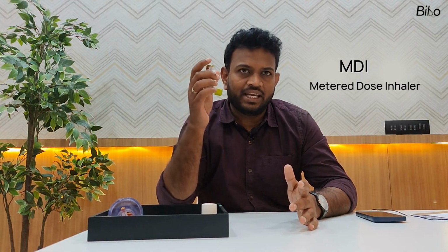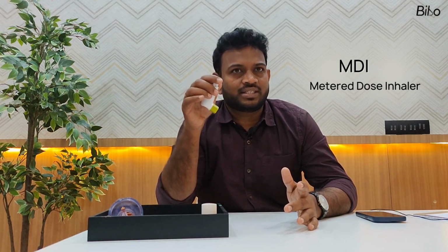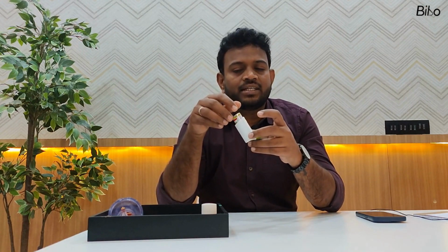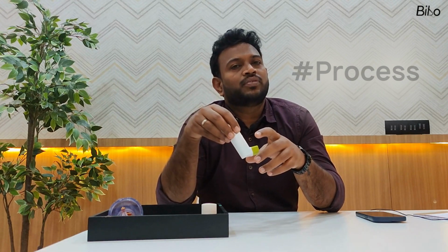Then going into the MDI. These are the most commonly used inhalers, MDI, where a lot of hand and breath coordination is required, so this has to be taken care of. The right technique is very important when we are taking the medicine. So what is the first step of taking an MDI?